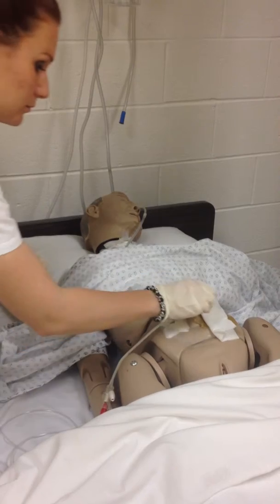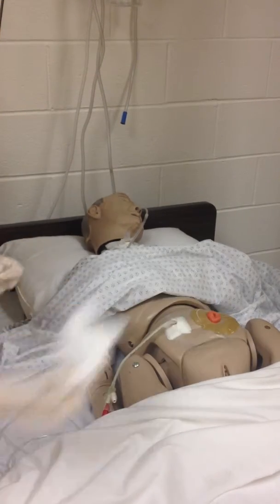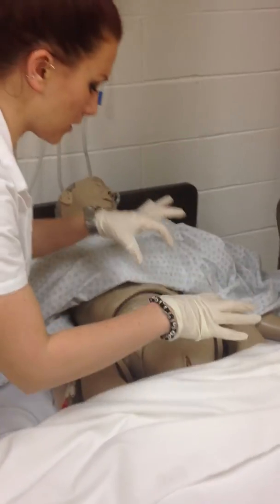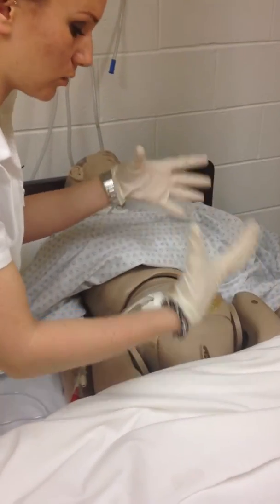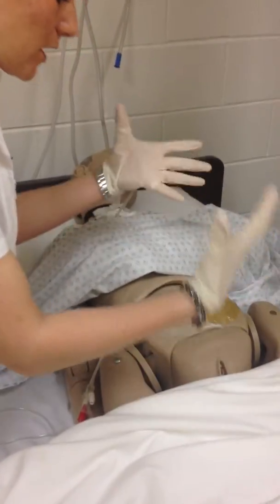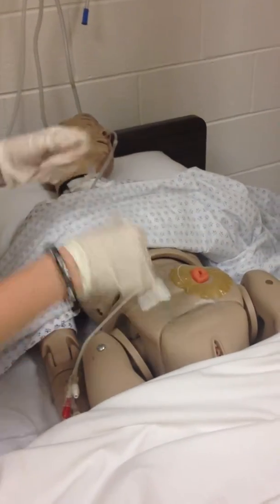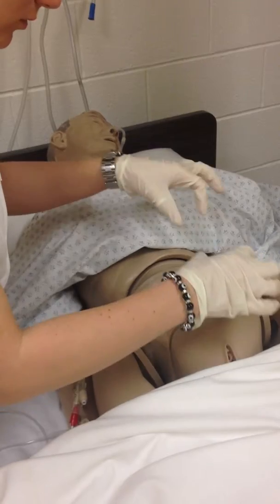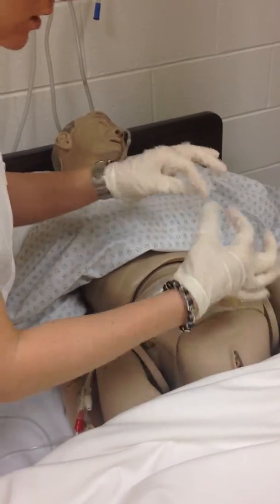We're going to assess the patient's wound. We're going to see how long it is, how deep it is, what color it is, whether there's an infection. Ours is a full-thickness wound. A little bit red, and there's this drainage.